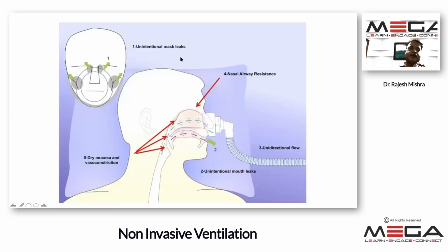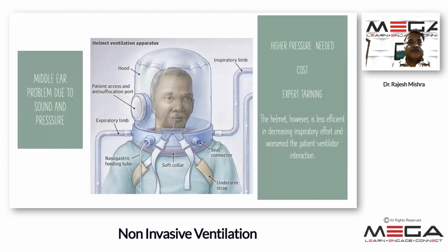But we have to remember that whatever kind of mask we are using, it is the leak around the mask which causes all the problems with non-invasive ventilation use.